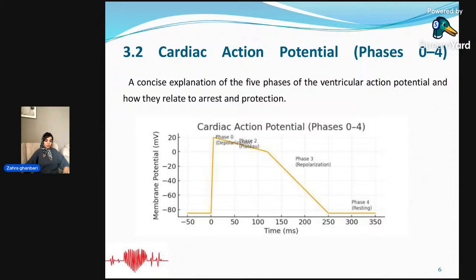No new action potential can be generated, and the heart stops in diastole, the relaxed state. So energy consumption and oxygen demand drop, and this protects the myocardium during surgery. But it's important to use the normal range of potassium. The optimal range leads to ideal myocardial protection.